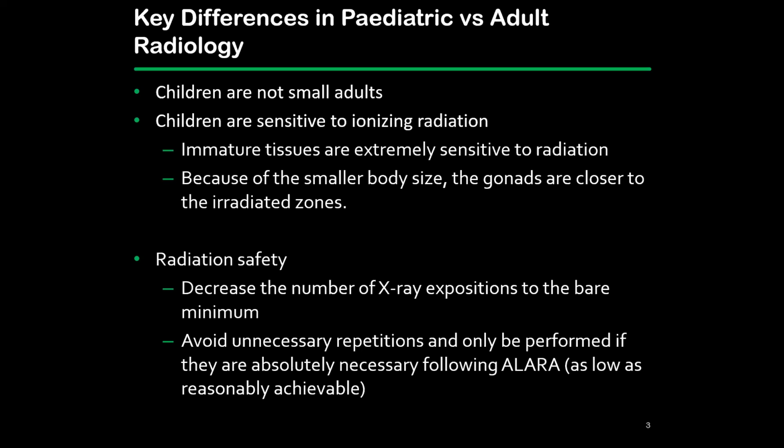Again, it's very important to take note of radiation safety and therefore decrease the number of times we expose these children to x-rays. For instance, in our setting, we may have a child being referred from one center to another, and the previous center maybe did an x-ray, and this x-ray was left behind. So by the time they get to the referred center, they need to take another one. So this makes it unsafe.